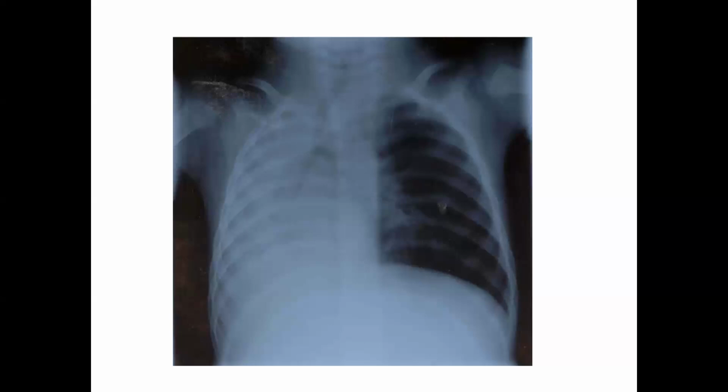It's also important to understand what puts off radiation and what doesn't. General X-rays, whether portable or in the department, put off radiation. CT puts off radiation, whether it's a regular CT with contrast or a high resolution CT. Positron emission tomography, PET scans, a lot of times can be done in conjunction with the CT if they suspect that a patient has cancer. Those utilize radiation as well.